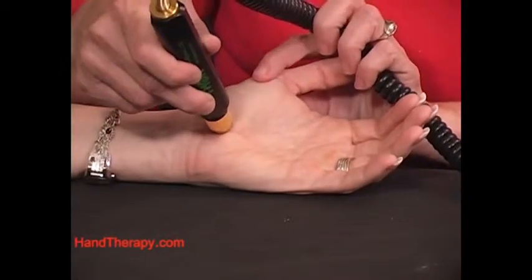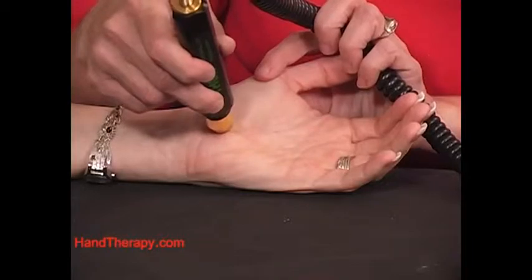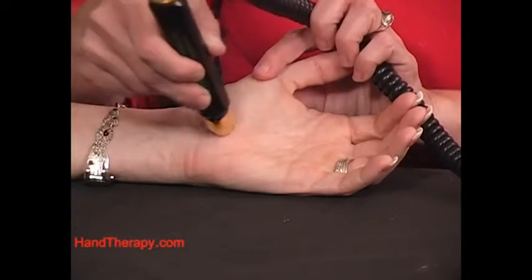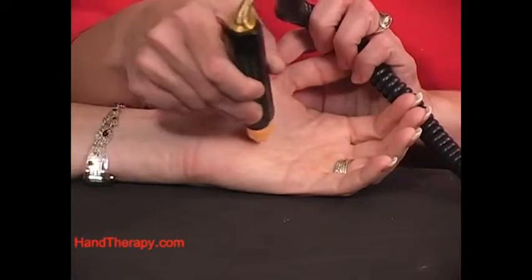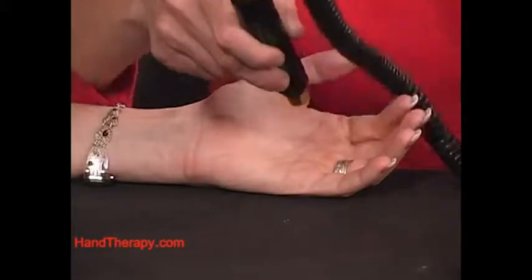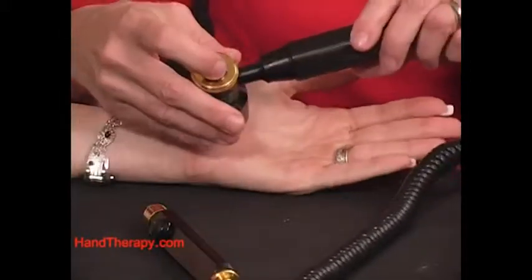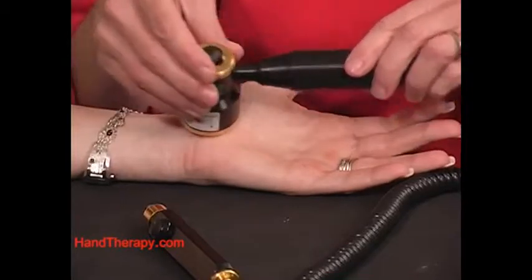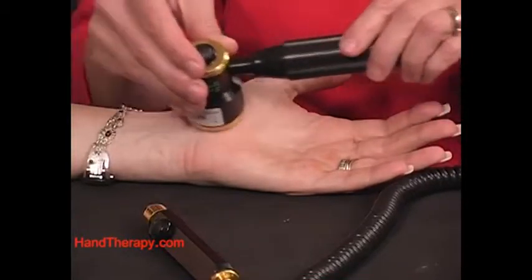You can do light compression and just press down, because remember that helps push the hemoglobin away. Or you can do a sweep, and this is what I wanted you to notice. So when we say sweep, this is what we're looking at, okay? And if I'm using the cluster, the same thing, I would just hold it there for contact. And then if I'm doing sweep, okay?